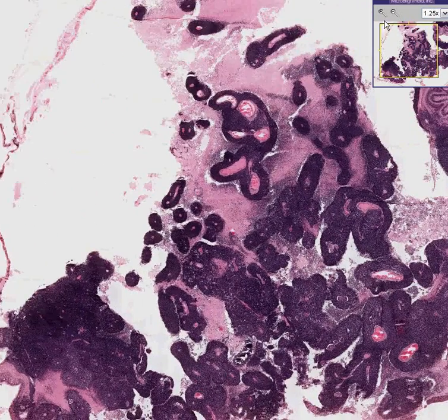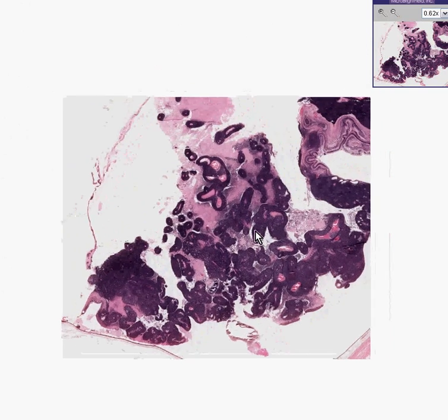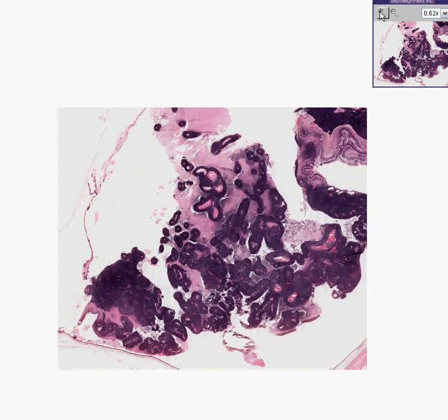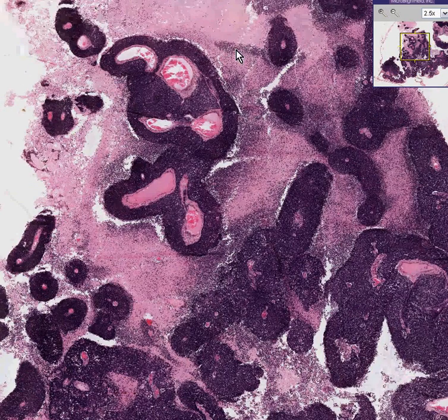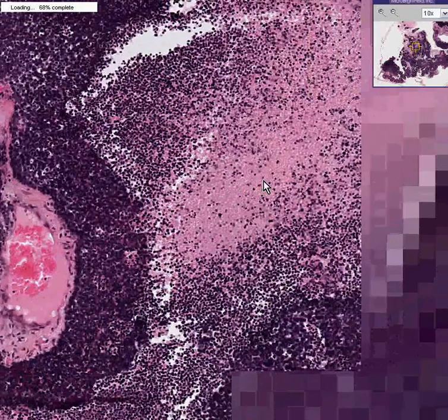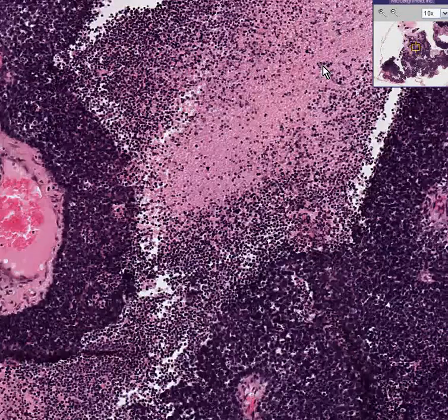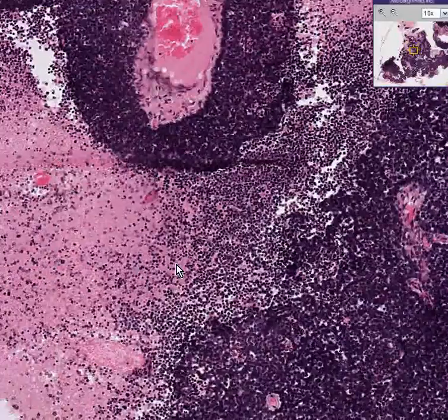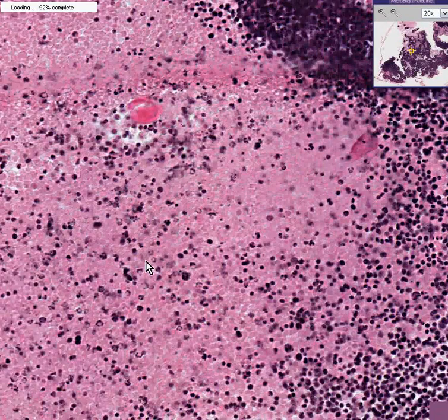What you do see filling up this eyeball is some type of tumor tissue that has several features. One feature is that it is extensively necrotic. All of this pinker, granular, cruddy area is necrosis. Some of it is blood, but most of it is necrotic tissue in which you can't really make out very good cellular detail at all.